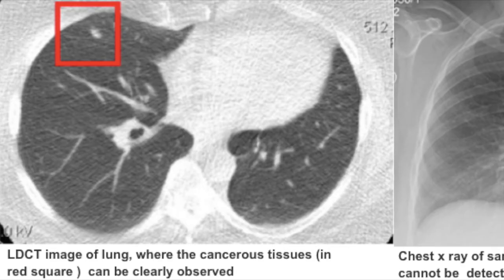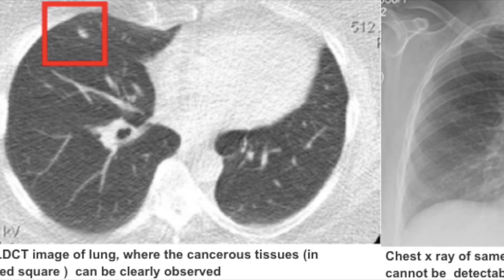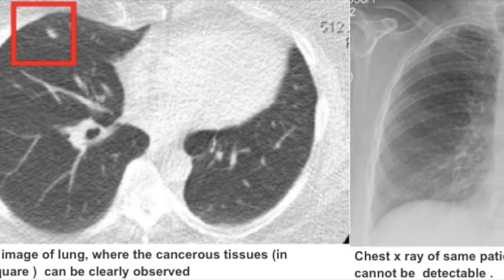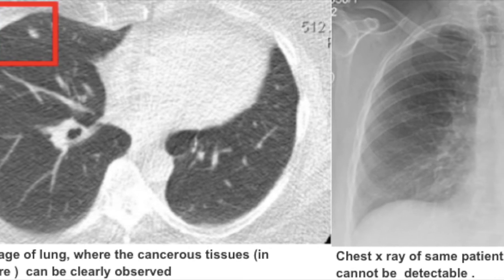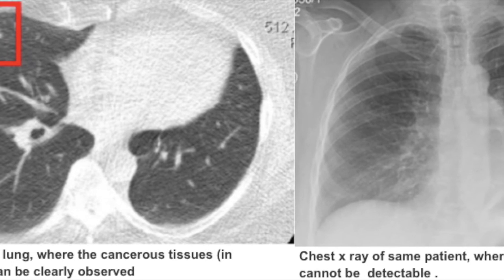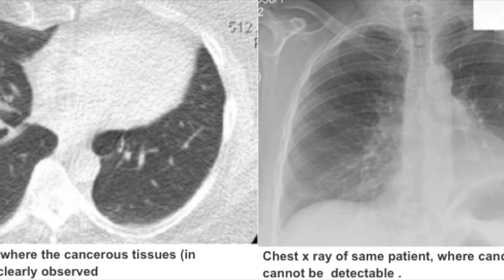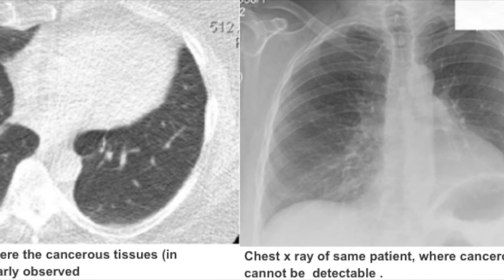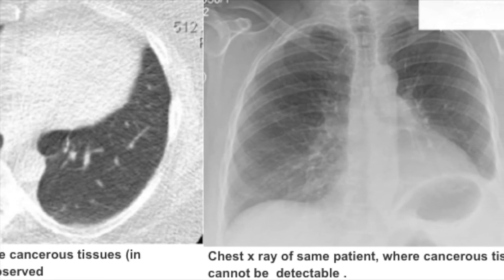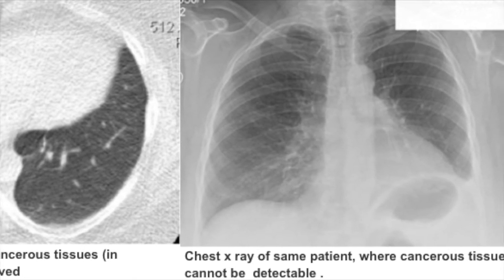The low-dose CT exposes the patient to less radiation, less than 10 mSv. Low-dose CT is capable of generating the image with detailed structure of lung tissue such as bronchioles. This gives it the capacity to effectively detect every nodule in the lungs. According to the Radiological Society of America, the low-dose CT screening is the most effective screening program for asymptomatic cancer patients, and it is proven to detect the cancerous tissue at an earlier, treatable stage, which in turn has reduced the cancer death rate by 20%.